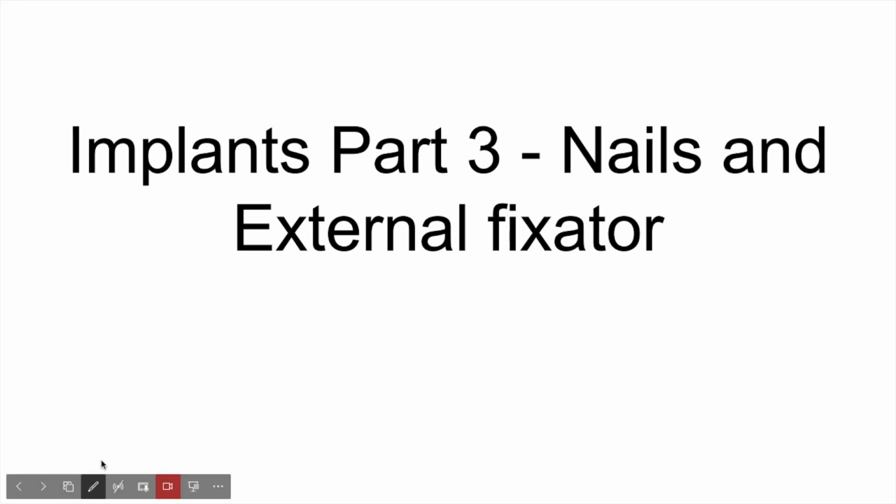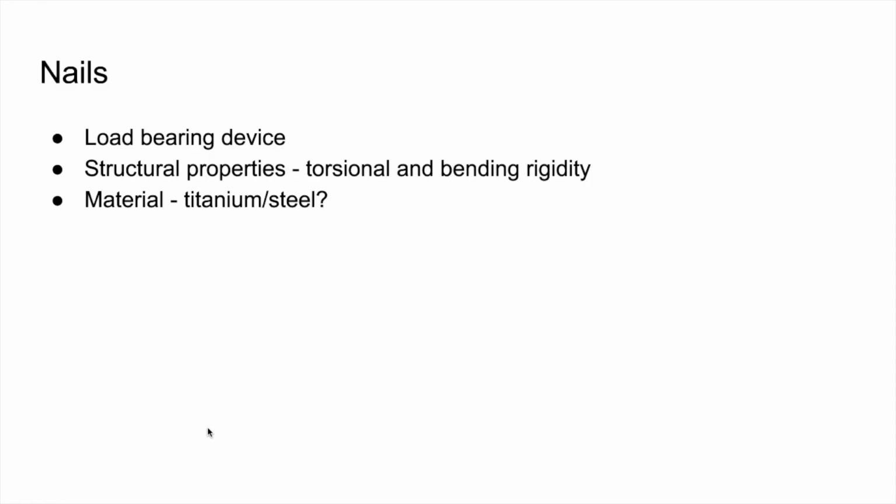Hi friends, today we're going to talk about implants, a little bit about nails and external fixators, right? It's a very vast topic. I'm just going to do it very briefly so that this helps you in your exam. It's not going to be a comprehensive talk about nails, right?